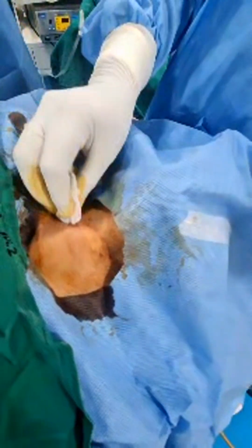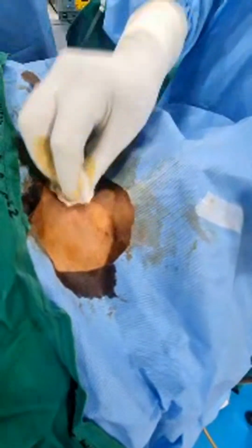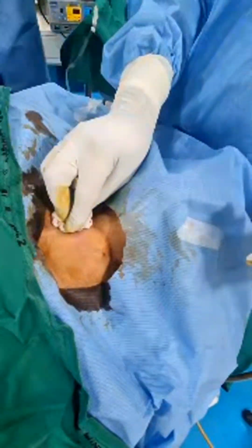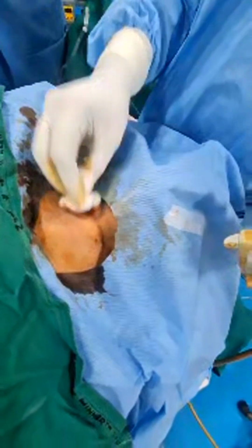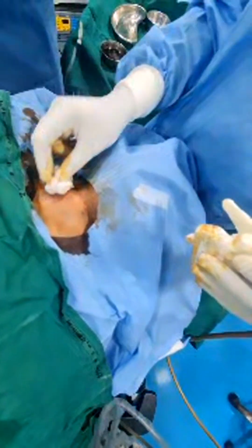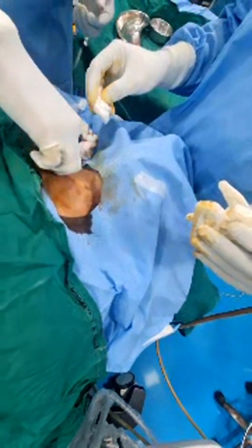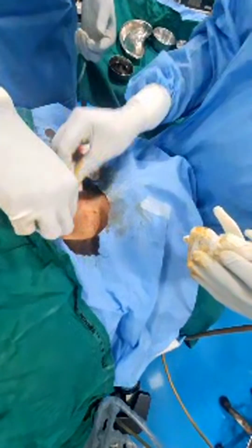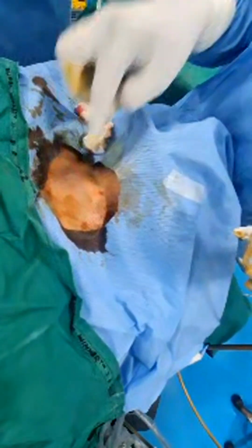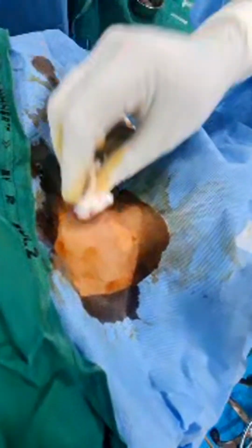So can you show the tip of this one? This is just the entry point. How much time did it take? Almost, yeah, in 3 minutes almost the entire nodule got ablated. So you can show this. There is no mark or entry scar or anything. That's the beauty of thyroid microwave ablation.